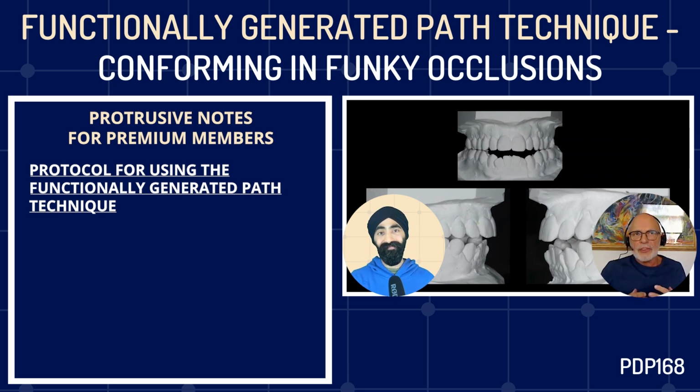They expect something to be perfect when you come to fit it. And if you spend an hour and a half adjusting it, I think the patient starts doubting whether you know what you're doing. So what I was looking for by falling back on the technique was predictability. And that was where this technique, I revived it, I suppose, and translated it into today's dentistry.